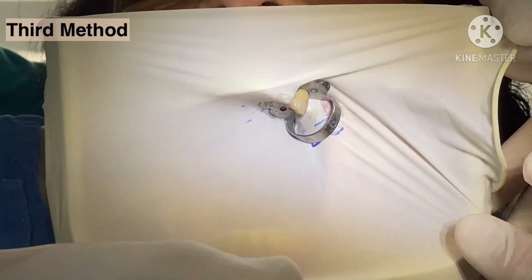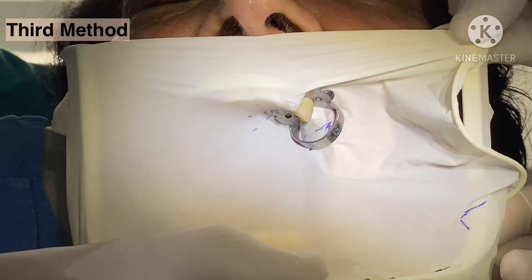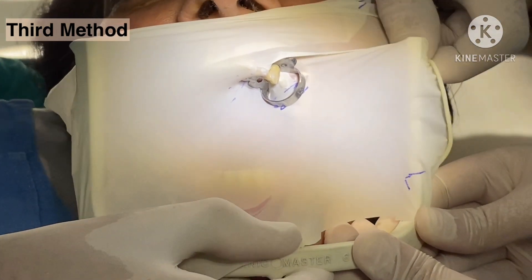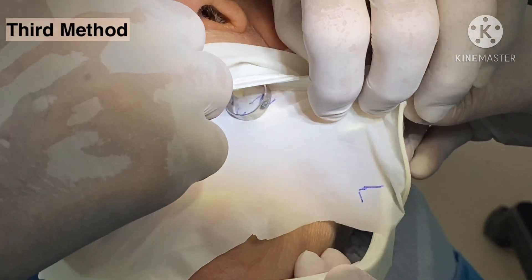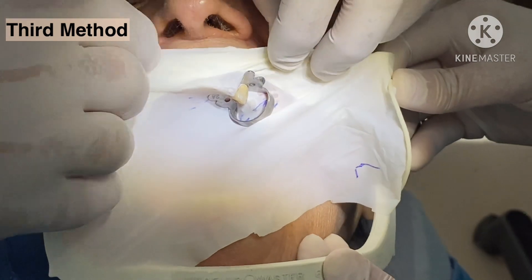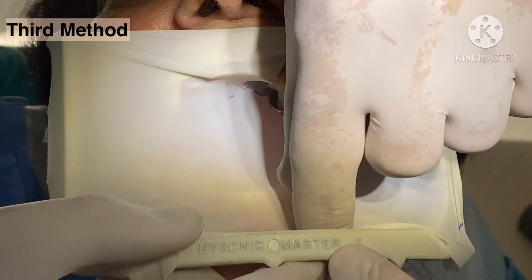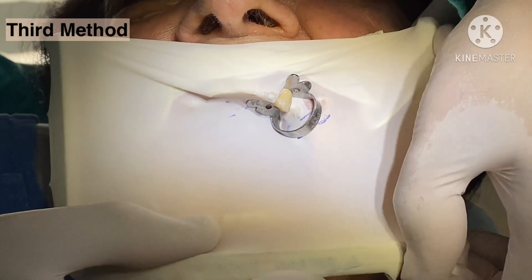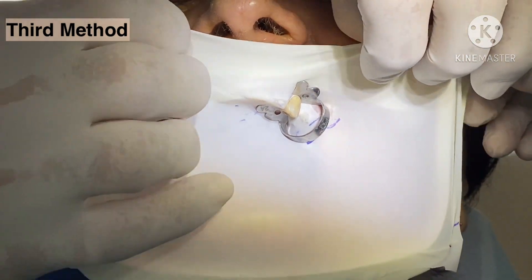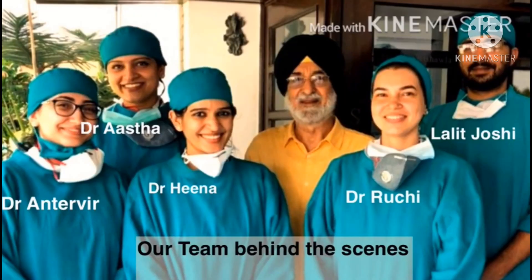Just a minute — now if it is covering the nose, what we do is loosen it and again place it parallel to the upper lip, and now you will find that it will be okay without covering the nose. It is very important that the nose should not be covered, at least when you are applying rubber dam for the first time on a patient.